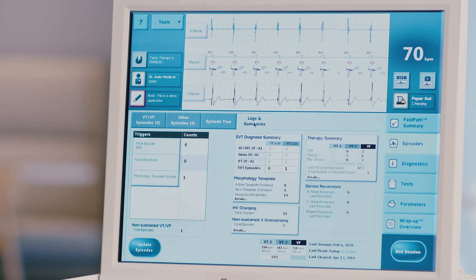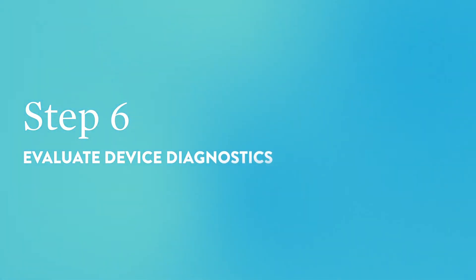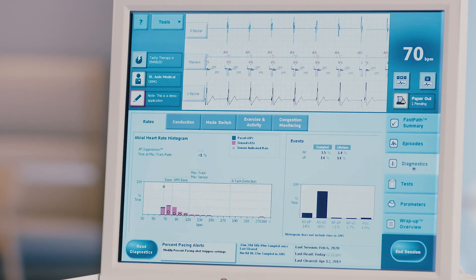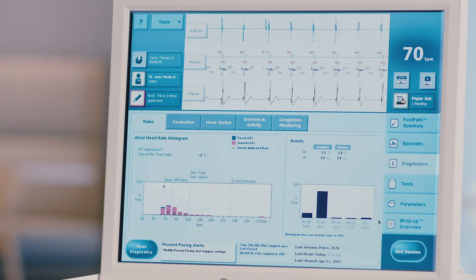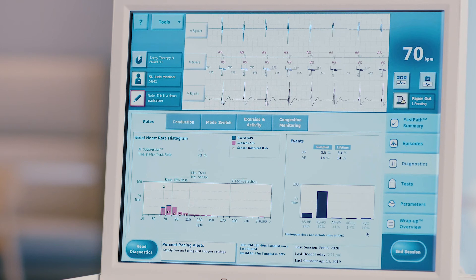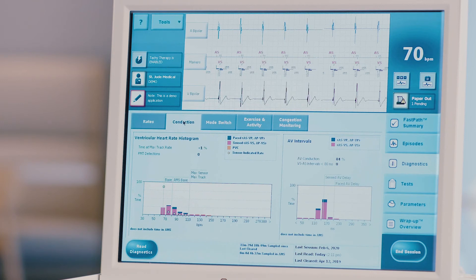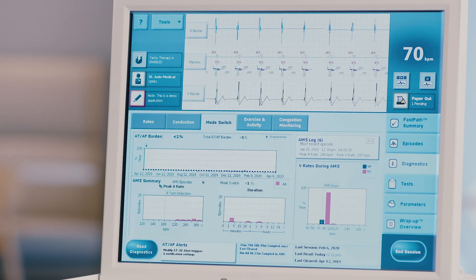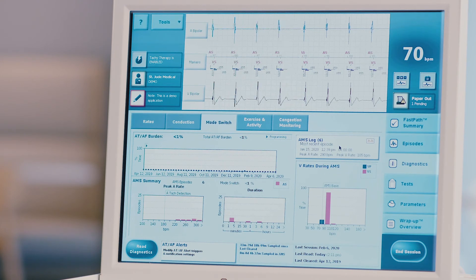Press the logs and summaries tab at the top of the screen to review the total counts for each episode trigger. Step 6: Evaluate device diagnostics. Press the diagnostics tab on the right-hand side of the screen. The rates tab will appear first. Evaluate the atrial heart rate histogram on the left side of the screen, and a bar graph of pacing percentages on the right, which will also show the PVC burden percentage. Press the conduction tab to evaluate the ventricular heart rate histogram. Press the mode switch tab to evaluate the AT/AF burden, AMS summary, ventricular rates during AMS, and the AMS log listing all mode switch episodes stored in the device.